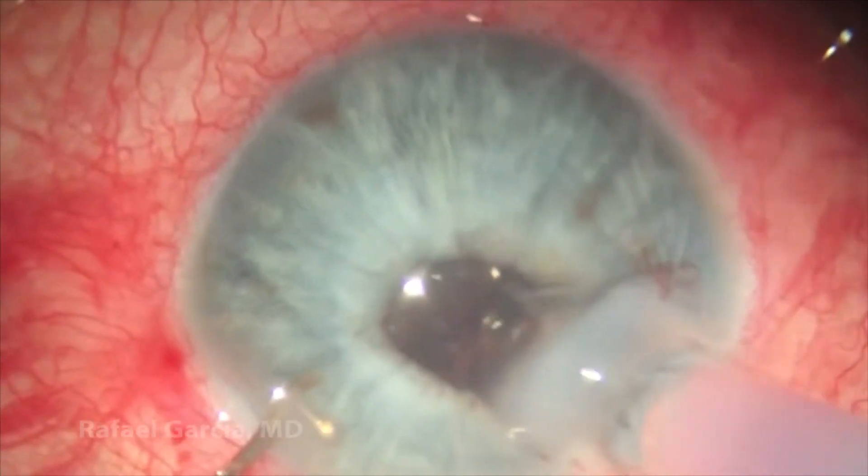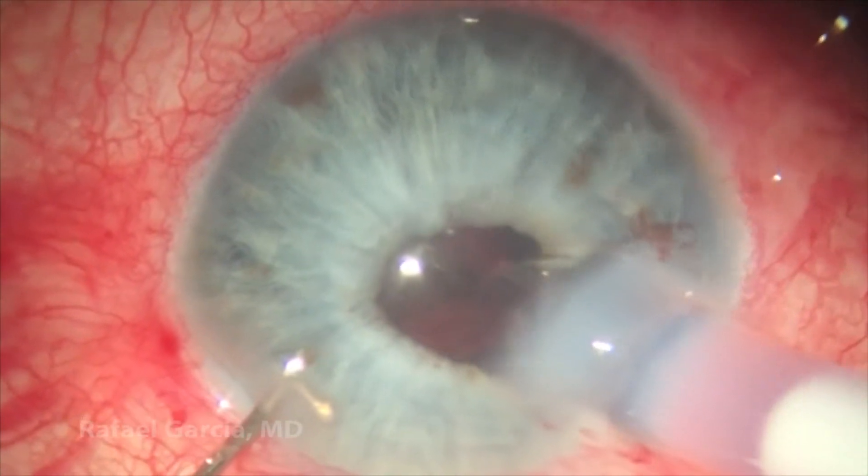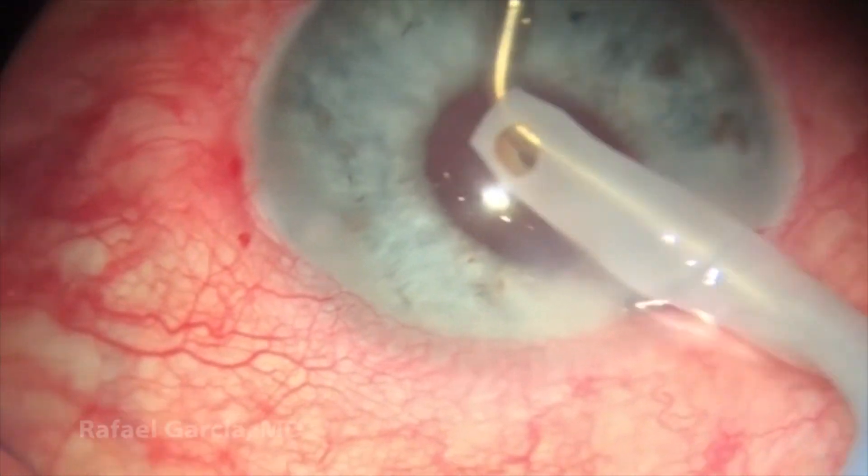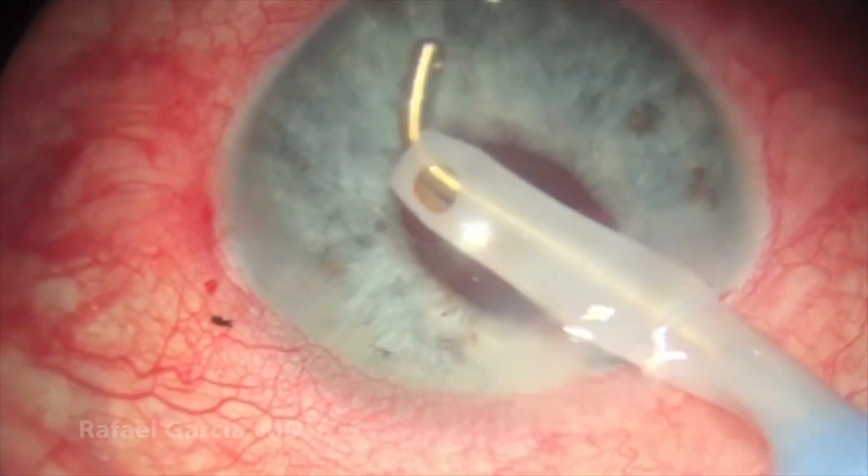Now comes the single-piece acrylic IOL that will be placed in the bag. Then the viscoelastic is aspirated with the I/A probe going all around the anterior chamber.